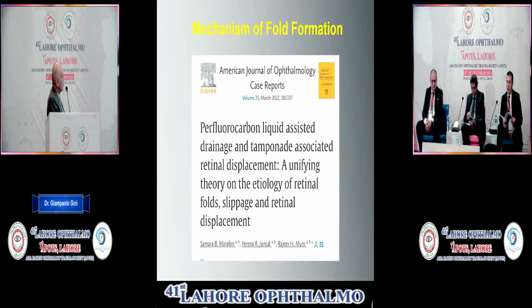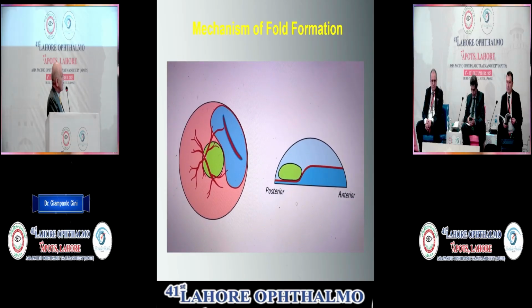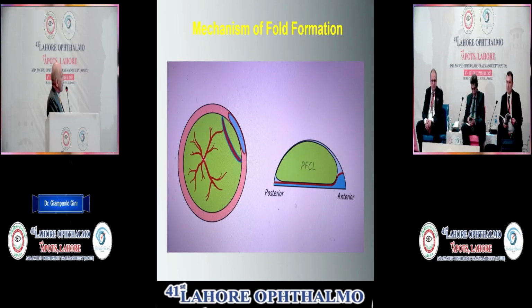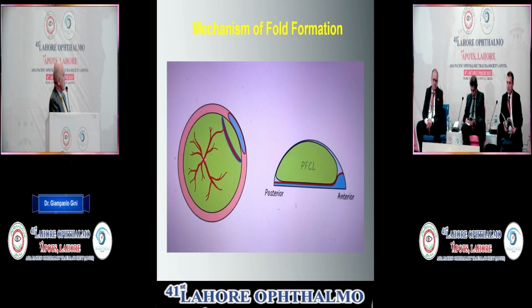But even better than my drawing, which is very amateur, there's actually a video which I've taken from this very good article, which I invite you to read, and you can see the dynamics of how the fold itself forms. So you have the fluid which is pushed to the periphery, and then the laser is applied here, but you can see that as the tamponade is placed back into the eye, the fold forms.